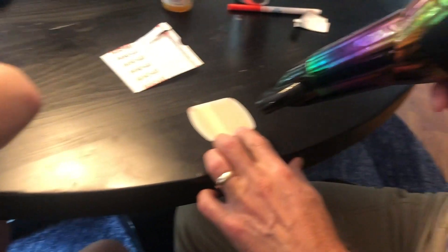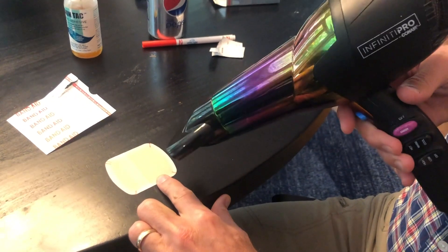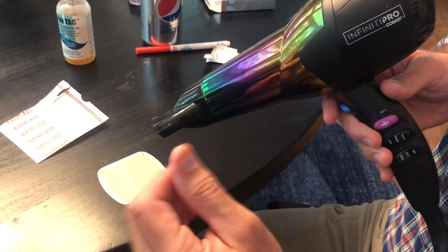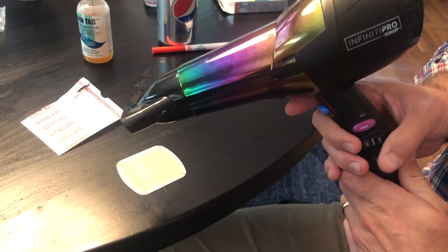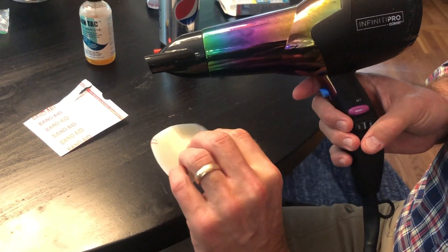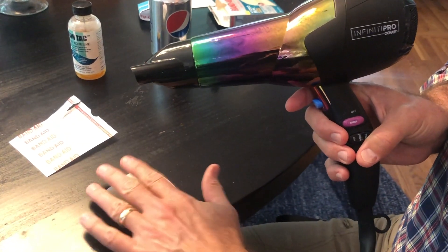I'm also going to use the hairdryer to heat up the HydroSeal itself. That makes it softer and more gummy, and you get a better adhesion to the area. Right now it's kind of rigid and wants to pop back up — when you get it nice and soft, it works much better.